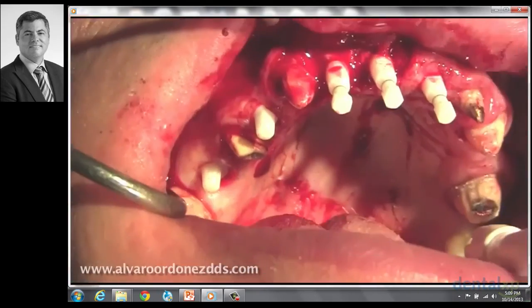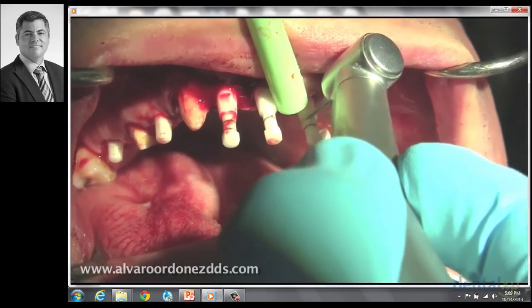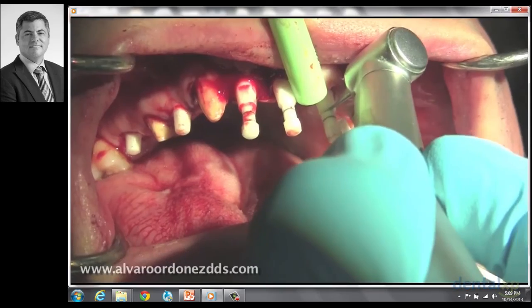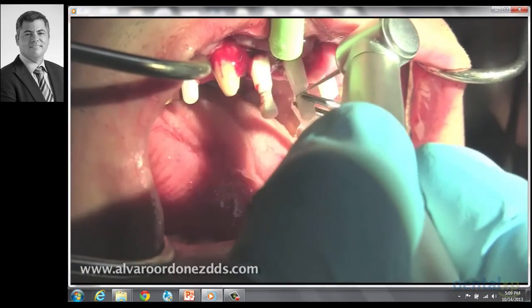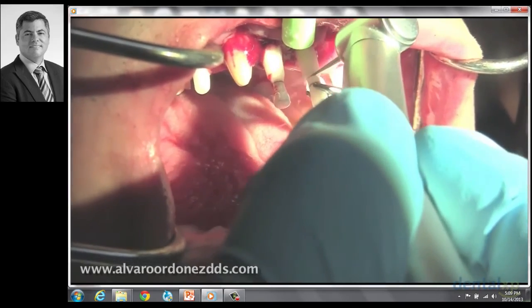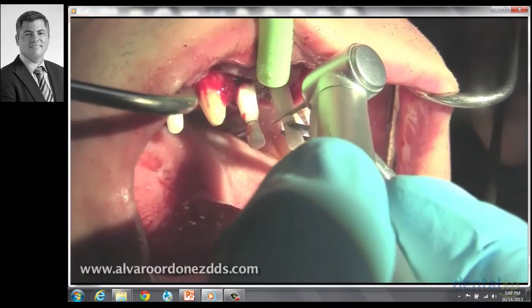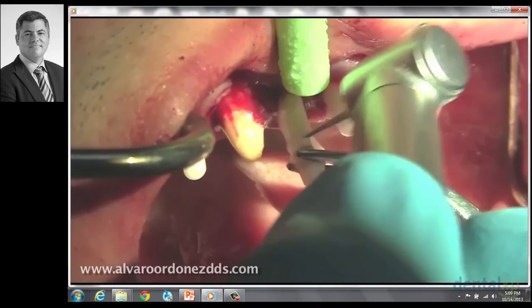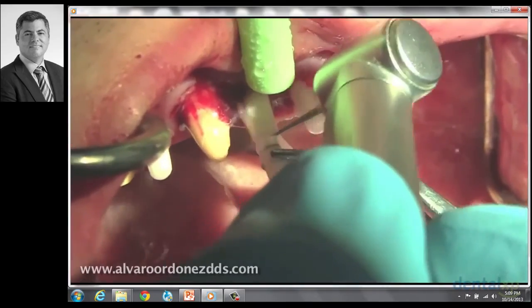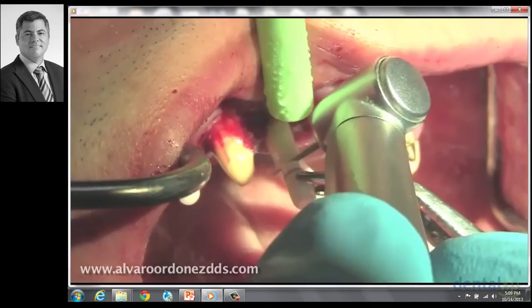I used to think that zirconia wasn't as strong as it is until I started playing with zirconia in crowns and bridges. I thought that the implants would be easier to prep and cut, and it's super difficult. It's easier to cut metal than to cut this zirconia. These are burrs that are provided also by the company. And we're removing the extensions for the placement head.